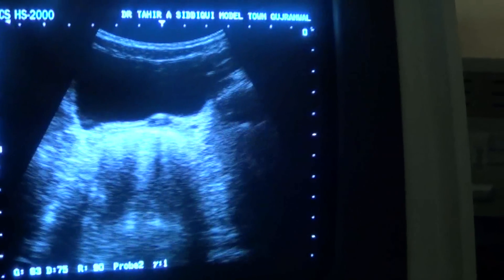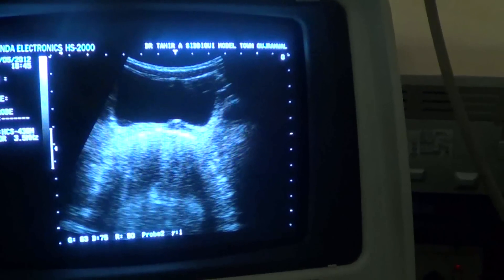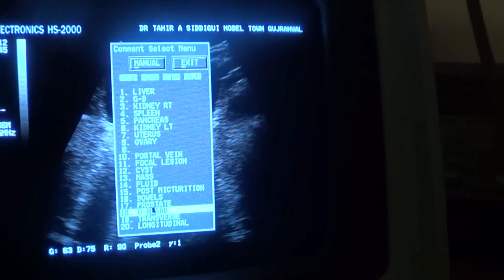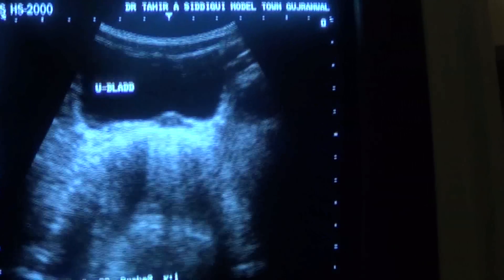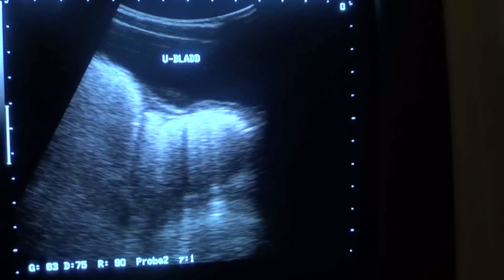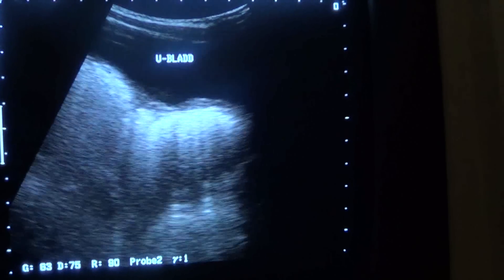Let us observe the urinary bladder in this age group. This is the urinary bladder in transverse section, and this is the urinary bladder in longitudinal section.